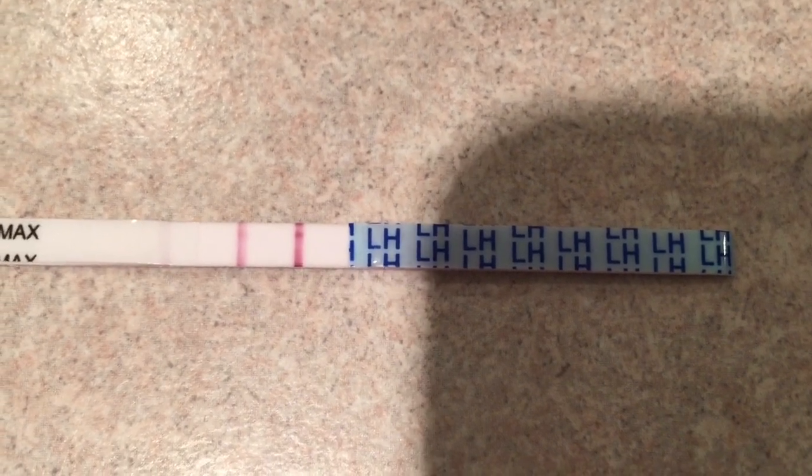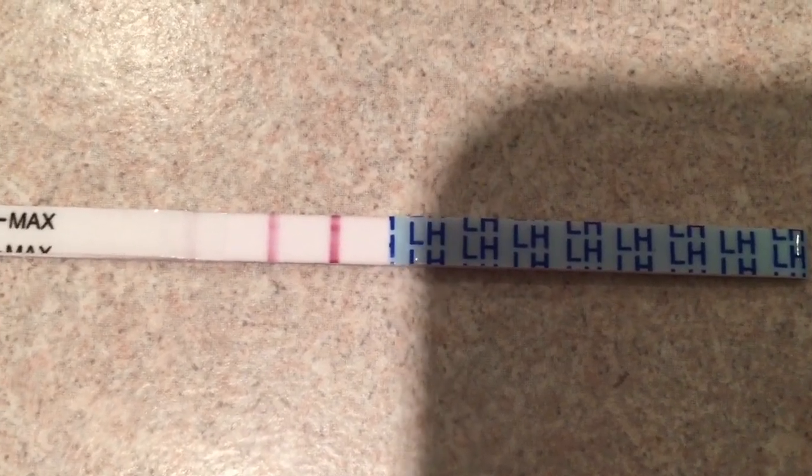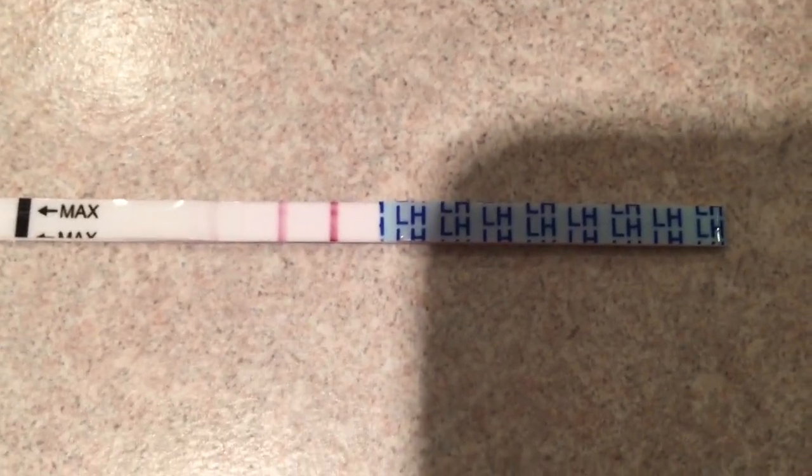So to start off, on cycle day 13, I had yet to get anything other than a low fertility status on my Clearblue fertility monitor. Then on cycle day 18, I got a high fertility status, so like a high chance of conceiving. That evening, I believe, I got an almost positive OPK. It was still negative, but it was turning darker. I could tell that it was probably going to be positive within the next few days. So that was exciting. I am cycle day 18 or 19, I can't remember, and my OPK is almost positive.